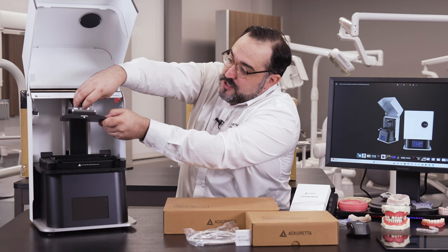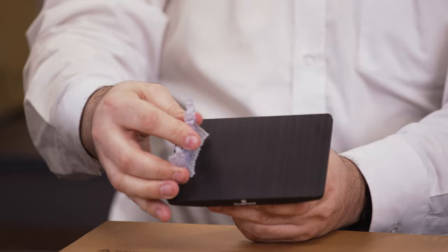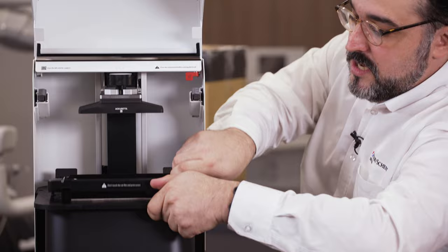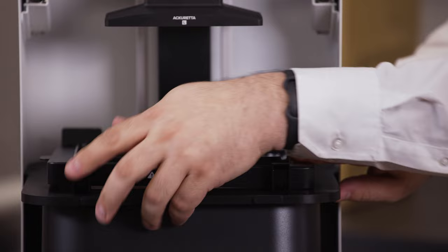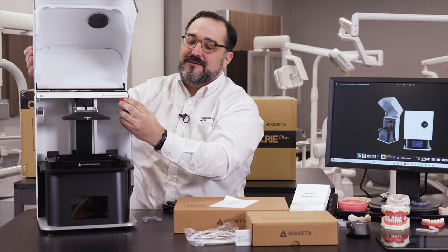One thing I'll say is the build plate doesn't seem like it can fit a lot horizontally, but people like to print things vertically — and if you print vertically, you can stack and fit a bunch of things, so don't get caught up in that. This is your resin vat. You'll notice it says 'remove from the bottom for printing' — because the laser has to shoot through the bottom clear material to cure each layer. It locks in with some safety features, and it's even soft-close, which is really cool.